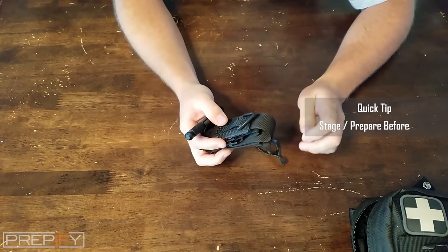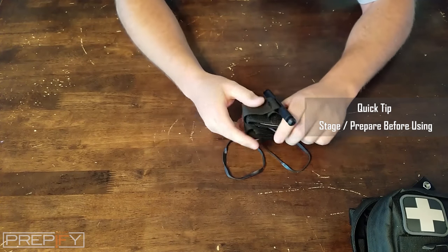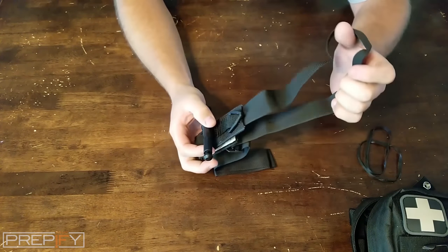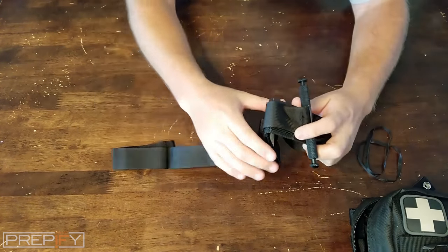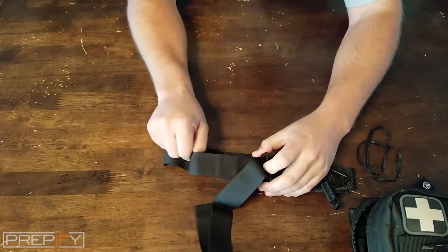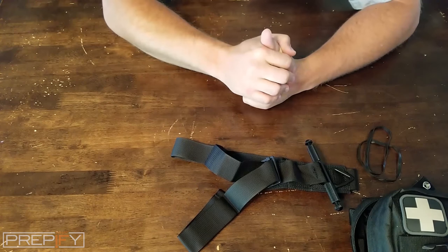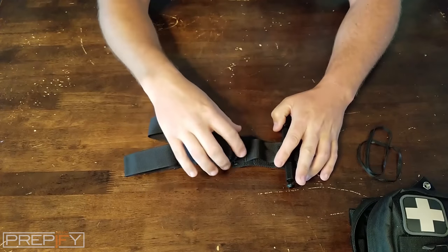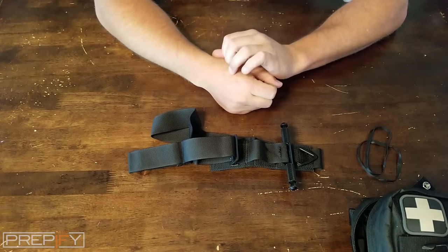You'll want to prep and stage it if you think you may ever need to use it. This one came in a plastic bag with two rubber bands — just take those off. When staging it, get the straps straightened out and add a little more room so it'll fit all the way around your leg or any large portion of your body. If you hit an artery and are bleeding heavily, you have anywhere from about 30 seconds to a minute and a half before an altered level of consciousness or going unconscious.